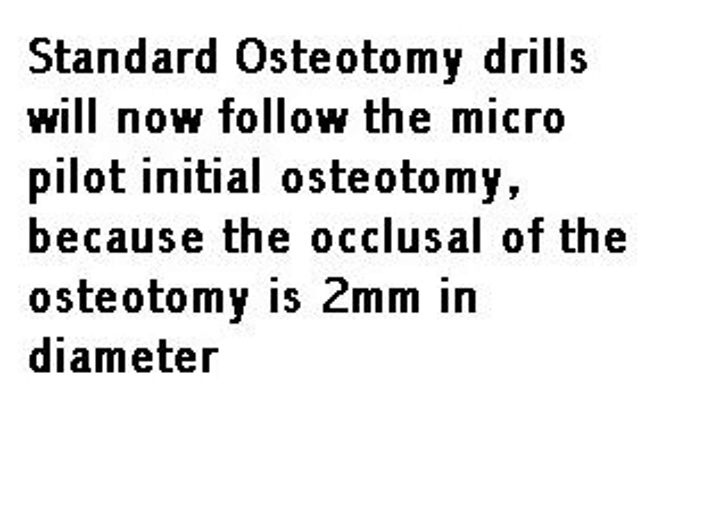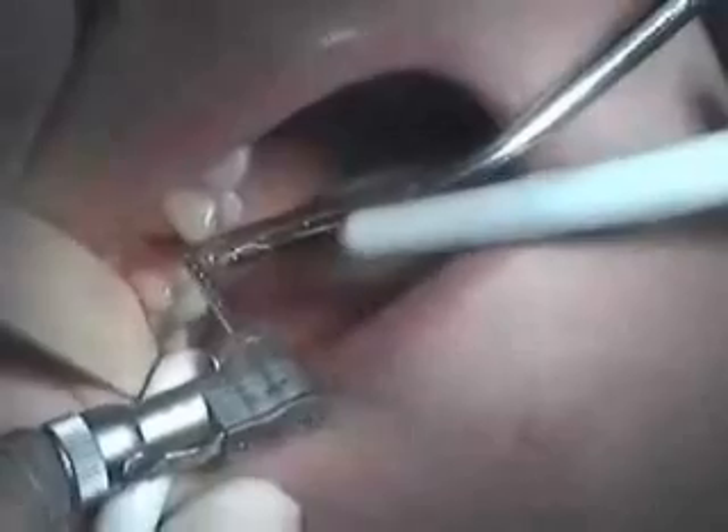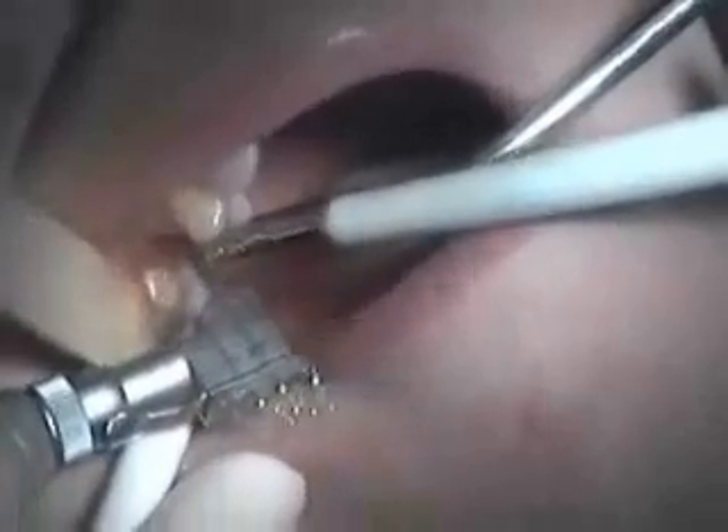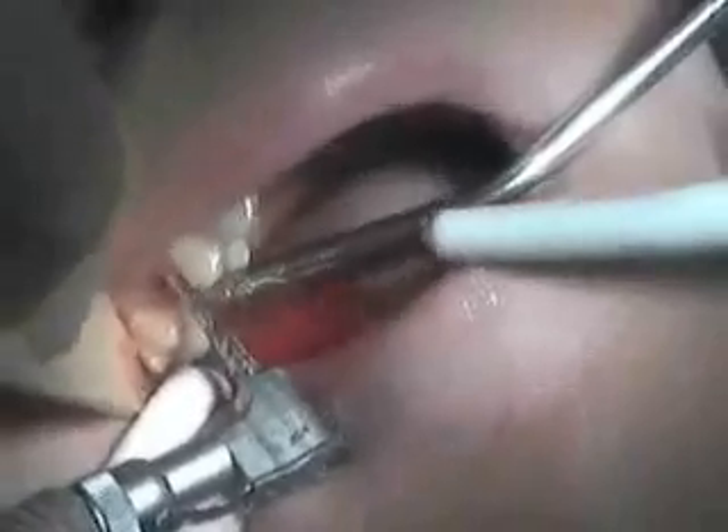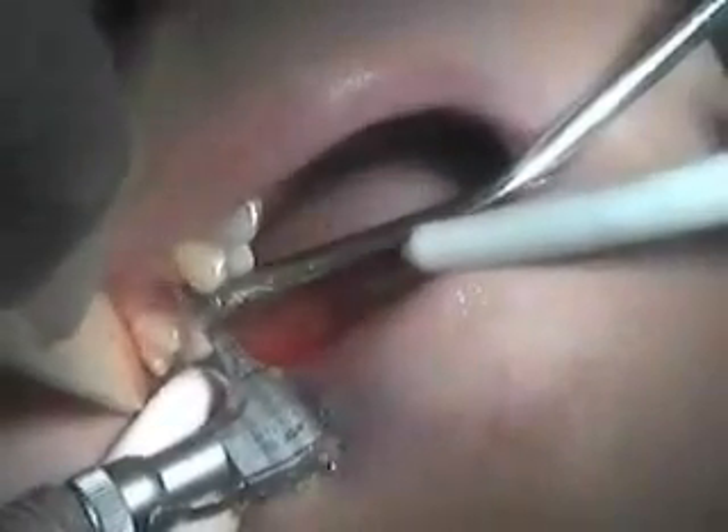This is the direction indicator. You can see we're in the right spot. Now we're going through a 2-millimeter twist drill, then a 2.8-millimeter twist drill.